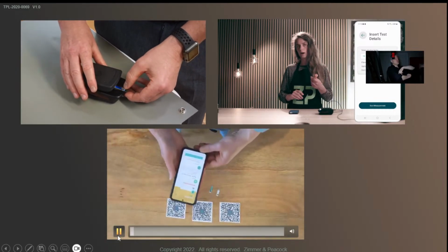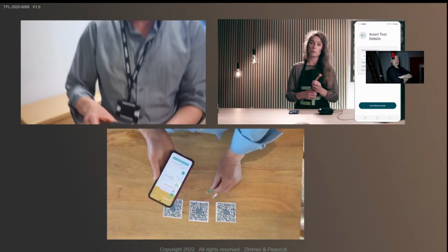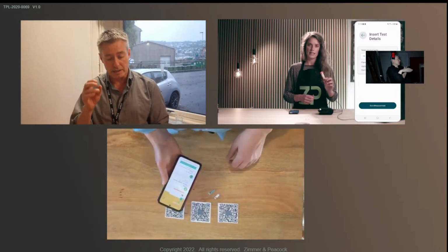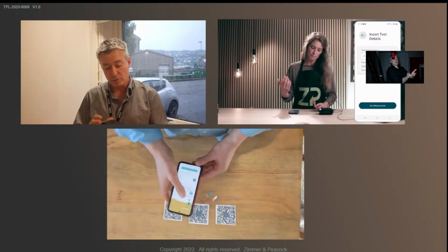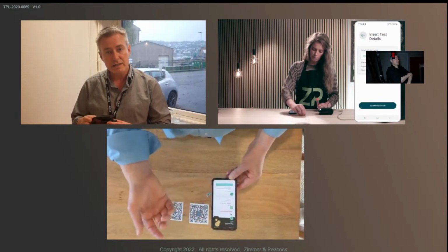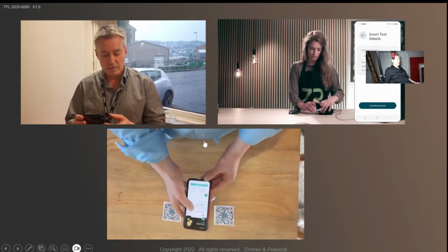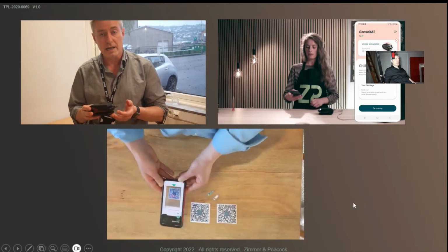And the nice thing is, if you've got multi-analytes, that one piece of hardware can actually do all of those analytes. We just use a QR code system. So let's say you were shipping a glucose sensor to somebody. The first time they opened up the app, it would ask them for a QR code. They would scan the QR code and it would say, oh, it's a glucose sensor, and off they go. If later on you wanted to do something like pH, there's actually a pH QR code and a pH sensor as well, so you can just change between quite easily.